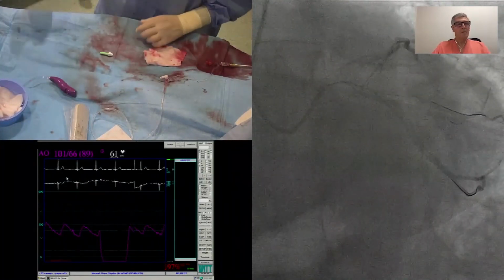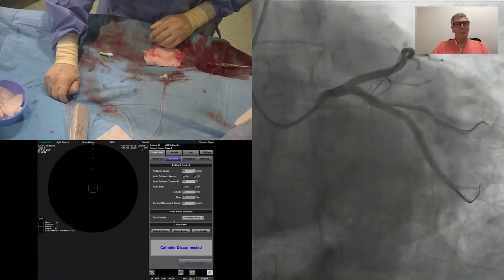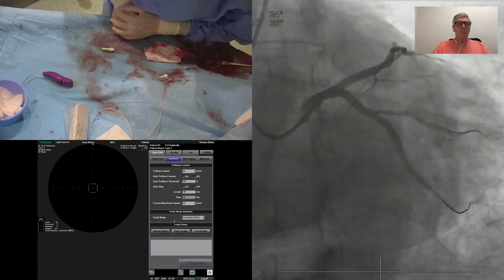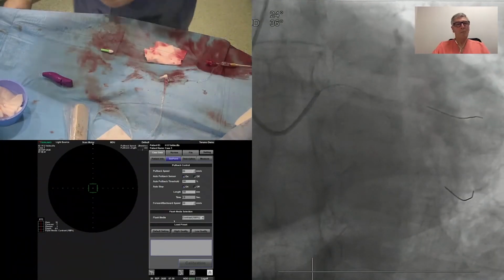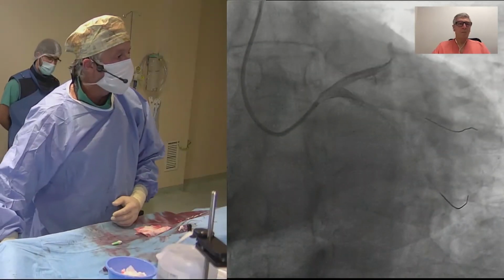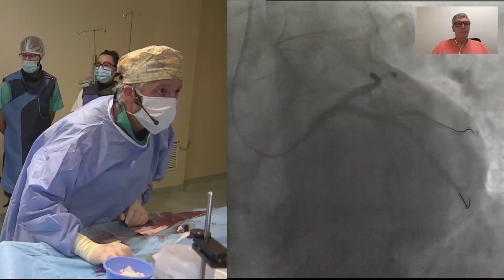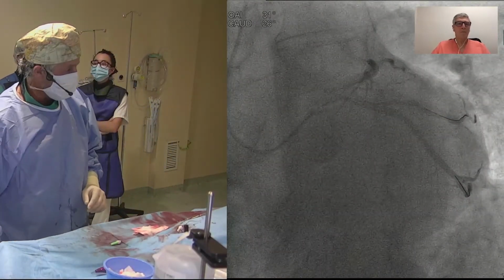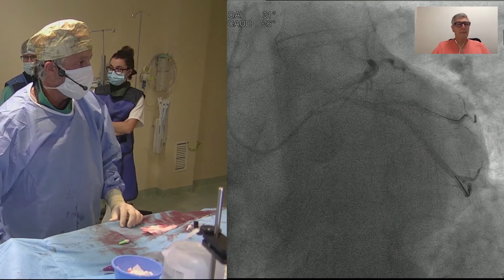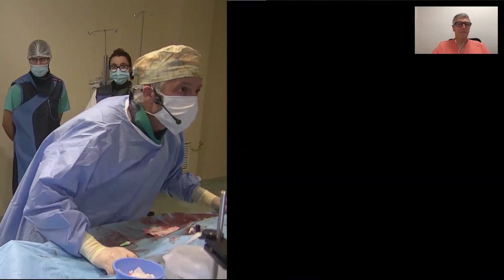Okay, prepare the OFDI. We are going to do the OFDI. Now, when we have the stenting and the side branch work done, we are going to do some projections. And we are preparing the Luna wave for OFDI and the catheter to check internally. That should be done in large bifurcations, particularly like this or the left main. It's very important to have imaging.